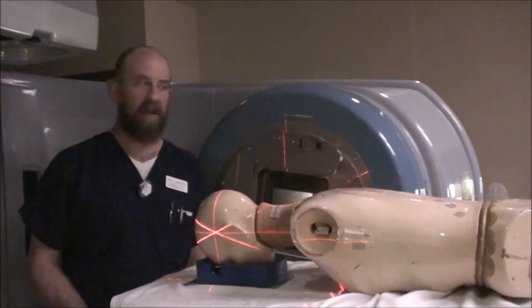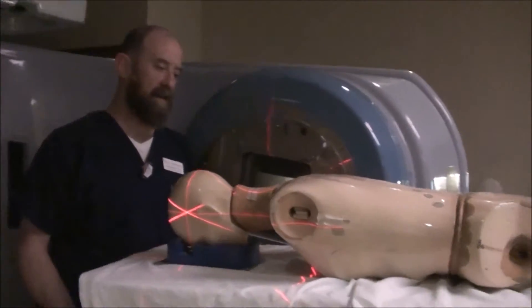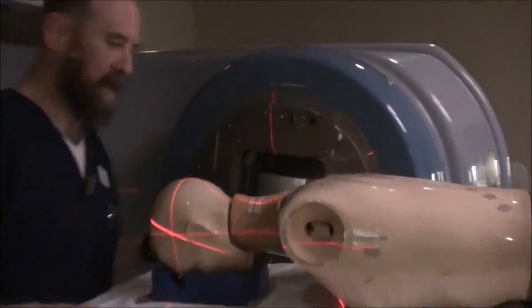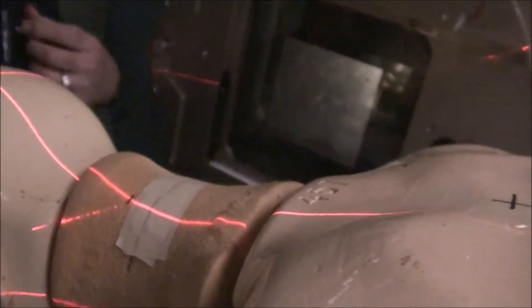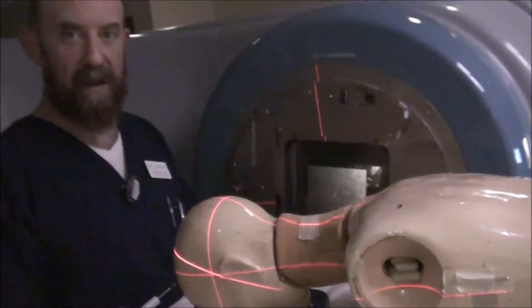You are then going to execute your table angle as determined in simulation. Once you have your table angle set, you're going to mark the match line. As I've talked about with match lines before, you don't want to just try to draw a line on the patient — you want to carefully mark exactly where that field is. You've got your dots along there, your SSD set, your three-point alignment with your table kick. You're ready to treat. Mark that match line, then treat the brain.